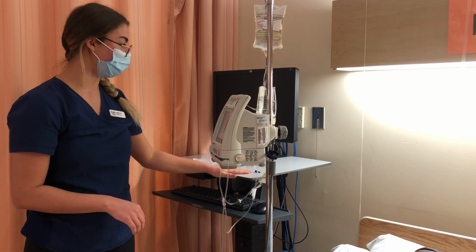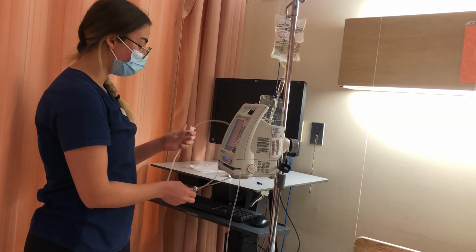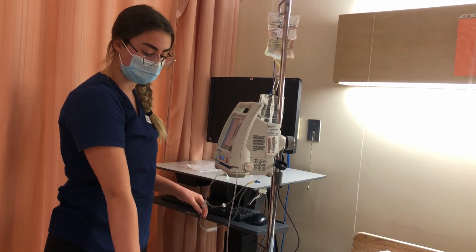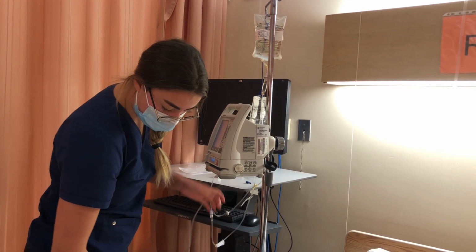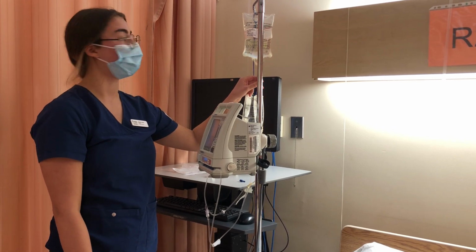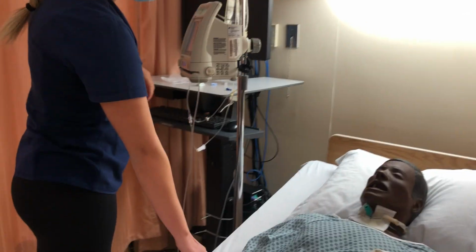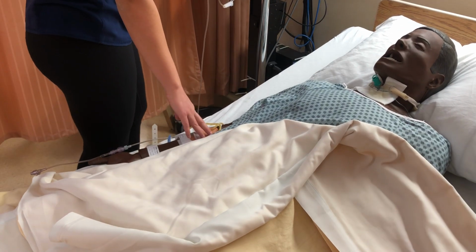Okay, so once I've done that, I'm going to press start and then open up my clamp, make sure all my clamps are open down the line. So I'll just check that. And then I'm going to wait for 3 drips out of the drip chamber to make sure that my secondary is ready. I'm going to assess the site. Do you have any pain? They say no. Okay, great.